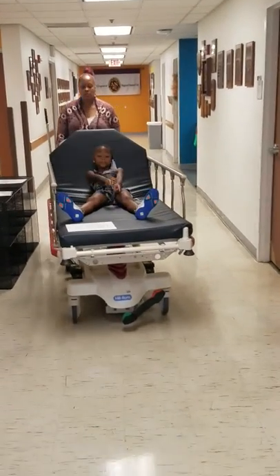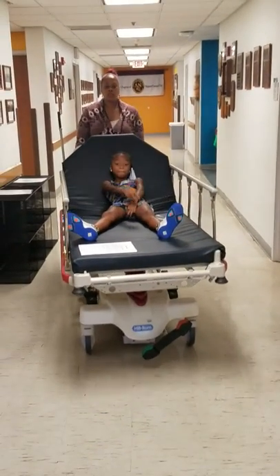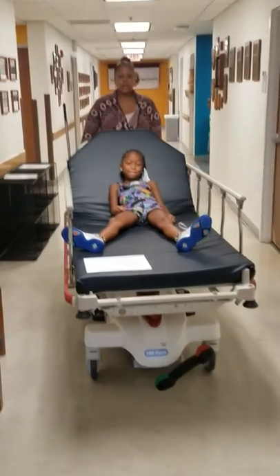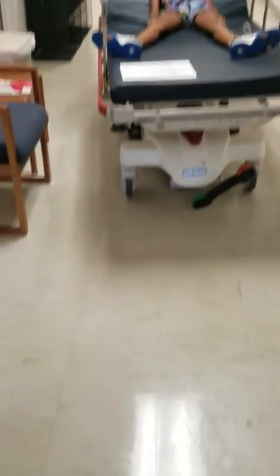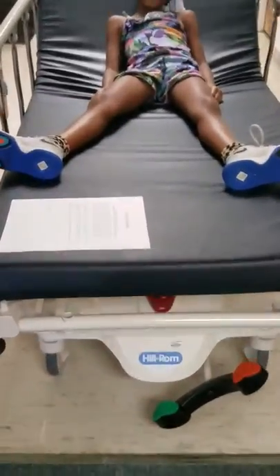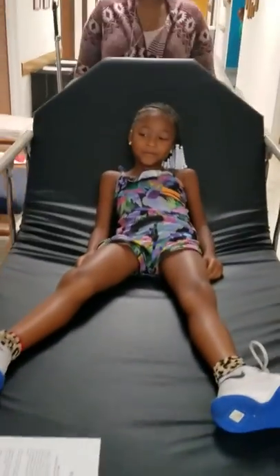If you're coming to entryways or elevators, you always want to let your patient know that there will be a small bump. Ma'am, you'll experience a small bump here. This is so as not to startle your patient.